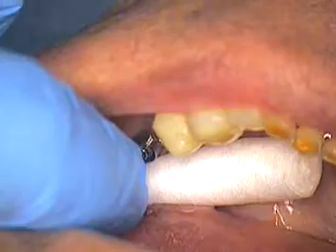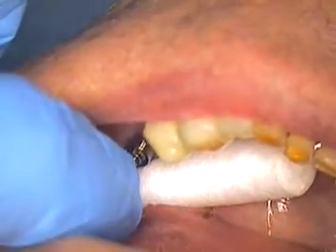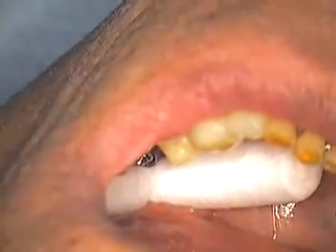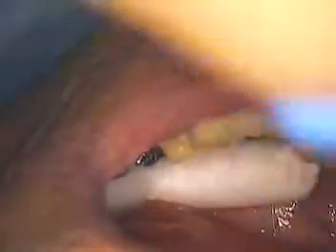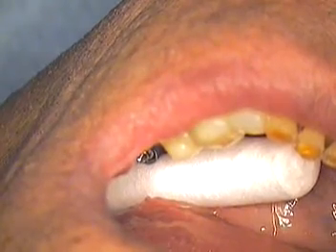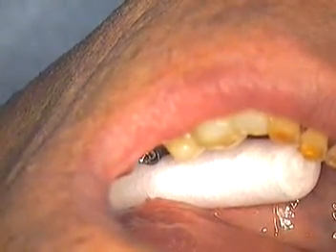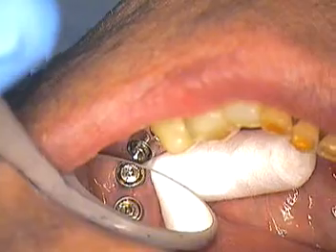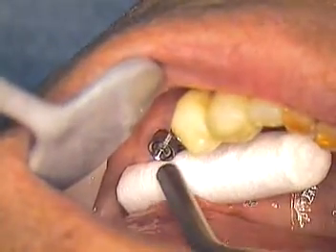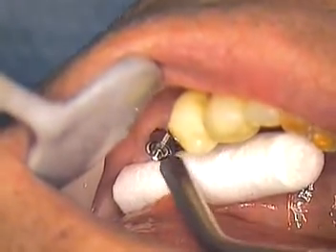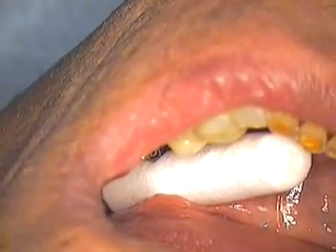We're looking through a dental microscope, about the power of about three and a half, and we usually go between that and five and maybe eight power. We'll just dry that off. And Larry, just turn a little bit toward me. Great.